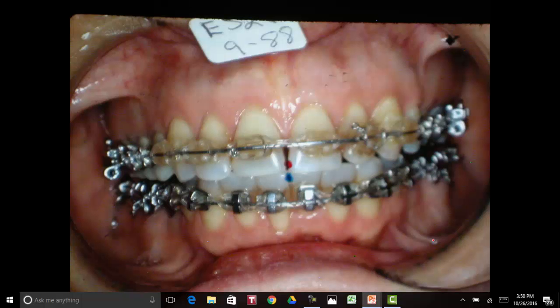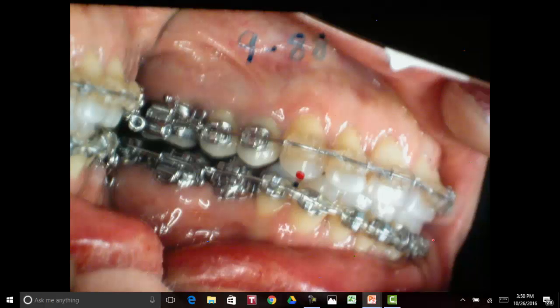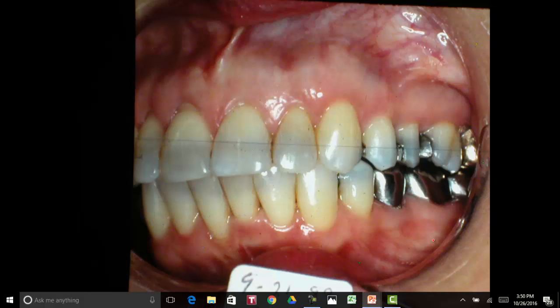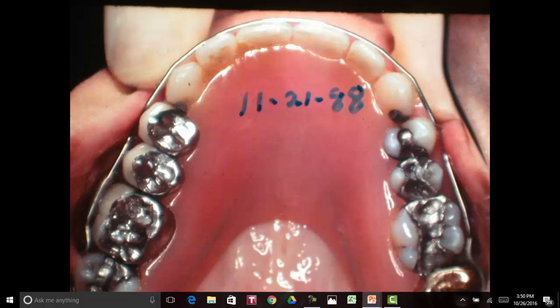I thought since she had to wear the rubber band all the time, I'd put a spring in. We got a little spring and hooked it up. She wore it for a short while but tended to bite it, so I took it out and just finished with elastics — that's all that was needed in her case. The midline is on in 1988. We're finished with the upper. The right side that was Class I is still Class I. The arch form balanced out. As far as I know, this lady never went back into Class II on that side.